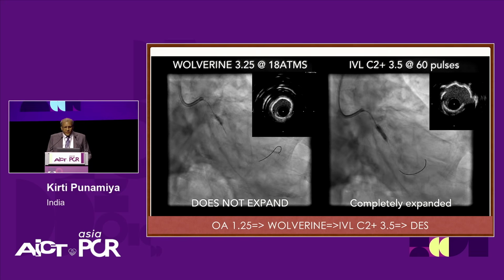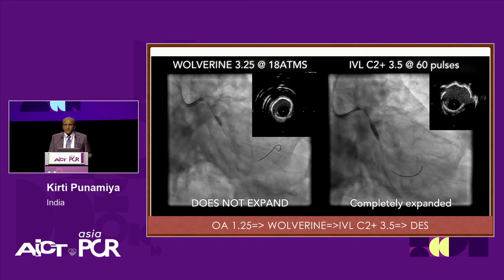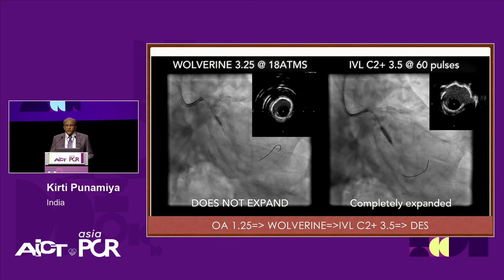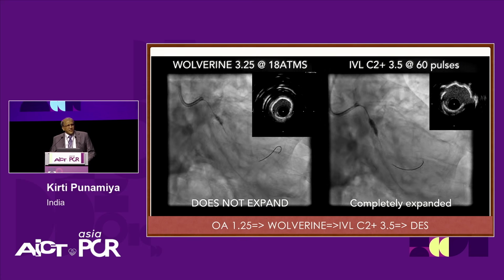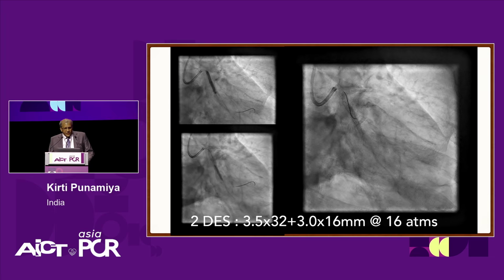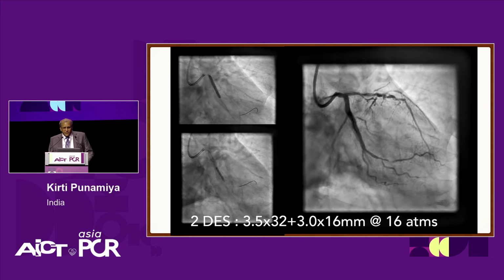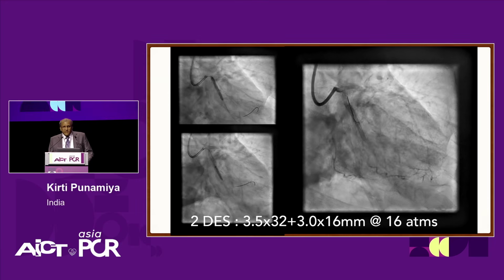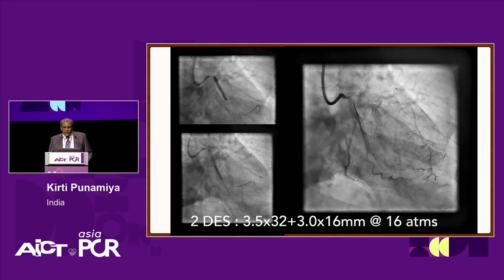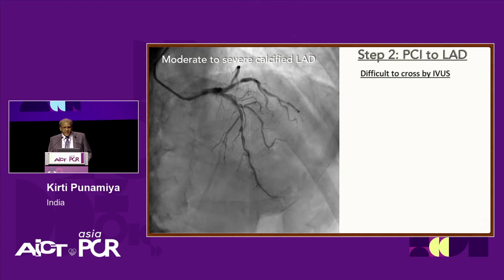This was the strategy, and you can see that circular calcium there cracks. IVUS demonstrates multiple cracks in that area, and expansion of the MLA. And it tells you that now you're ready for stent delivery, which we did, 2 stents downstream into that circumflex. And the IVUS showed that we had to optimize it with further dilatations to achieve our optimal MSAs.